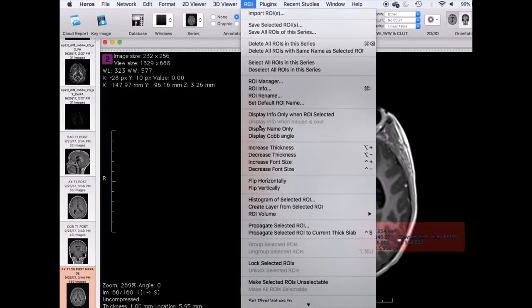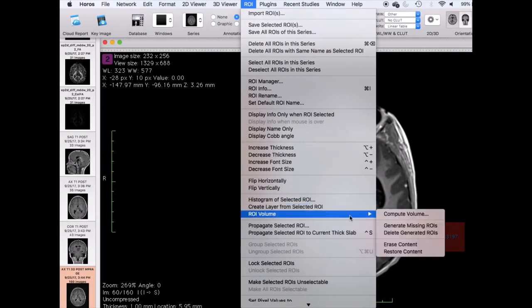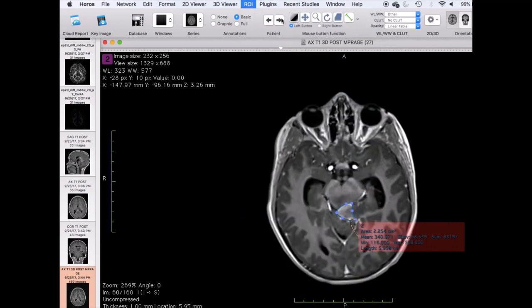Next, select ROI, ROI volume, and generate missing ROIs. This will fill in any missing ROIs in the slices.